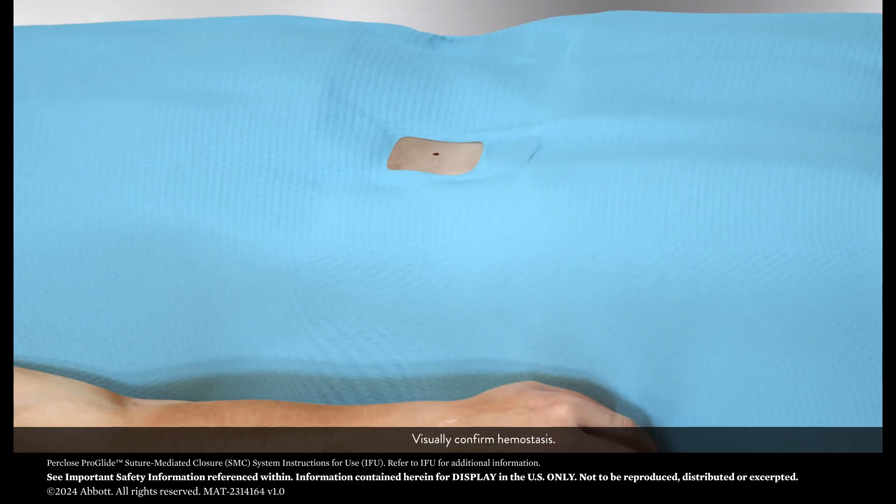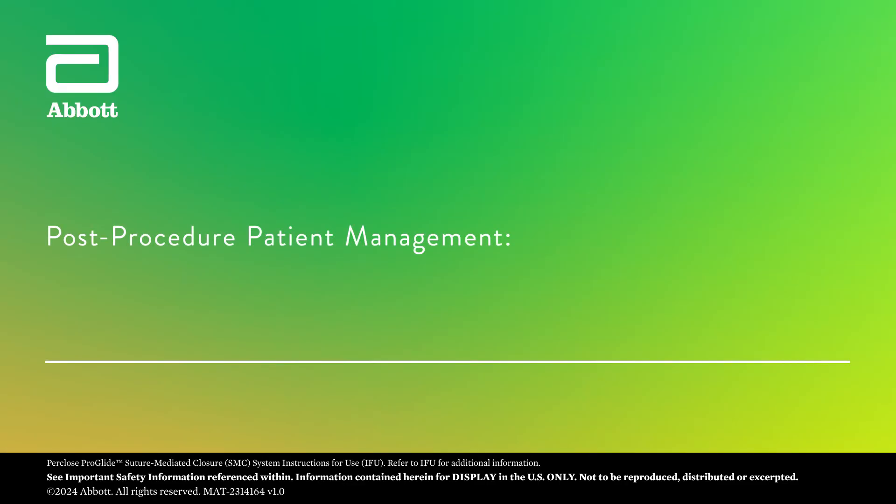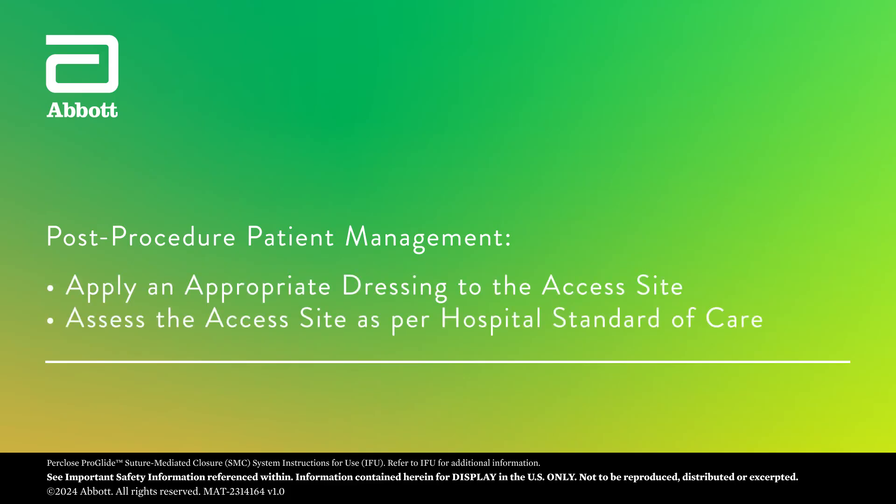Visually confirm hemostasis. Apply an appropriate dressing to the access site. Assess the access site as per hospital standard of care.